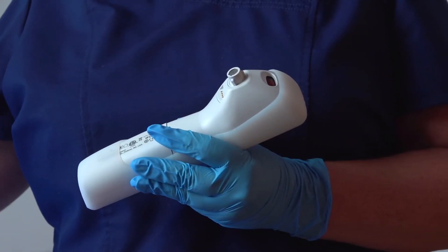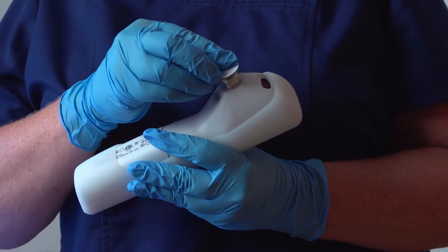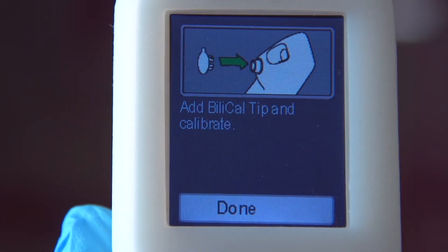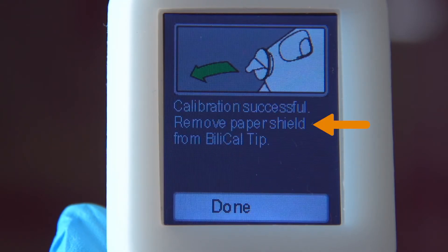Now we need to attach a new BilyCal tip to the handheld unit. Press it on to the unit until you hear a click, which confirms proper seating. Select Done to begin calibration. When finished, the unit beeps and displays this message.